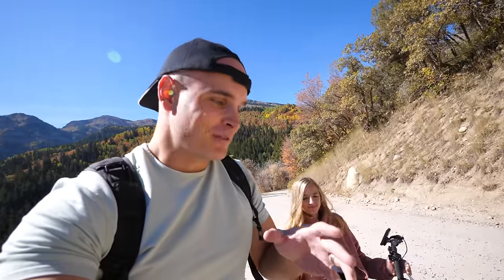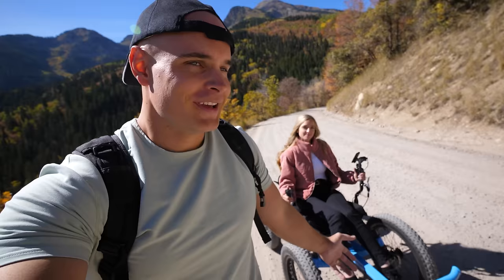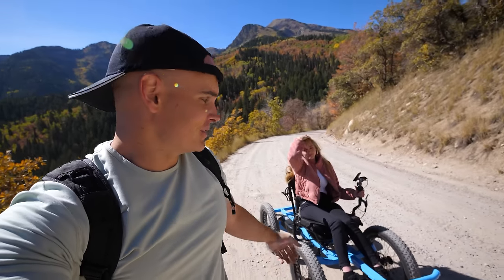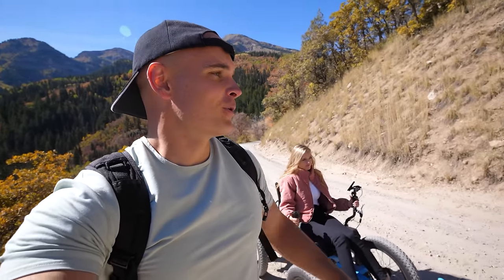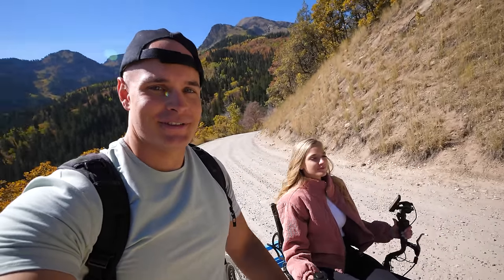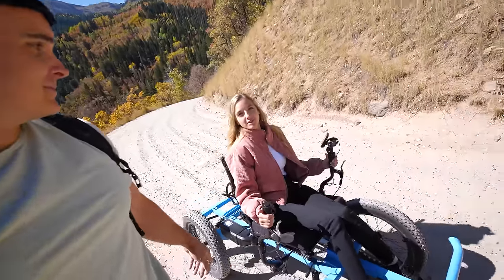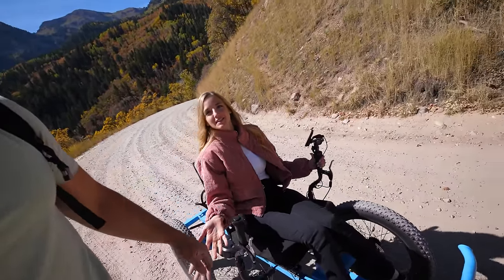Some off-road vehicles are very loud, but ours is not one of those. Since it's totally electric, there's literally no sound coming from the motor, which makes for a more realistic nature experience. It's a more peaceful environment when you're off-road without devices making loud noises.